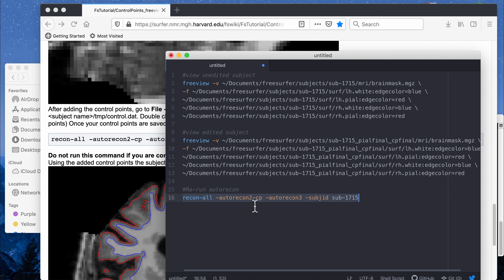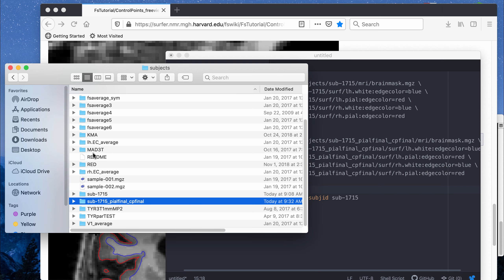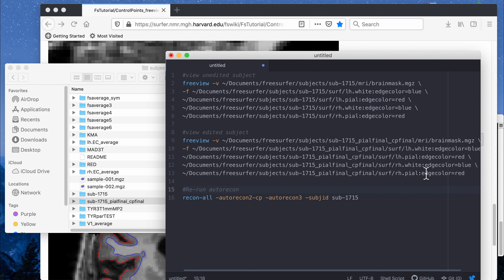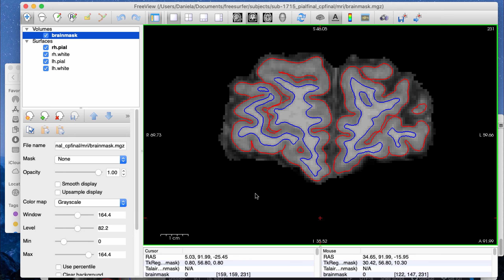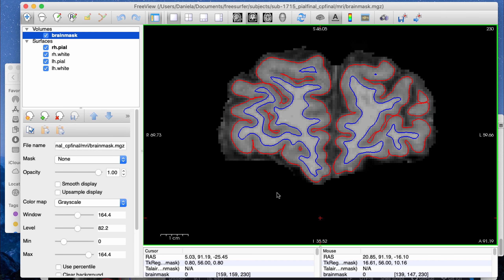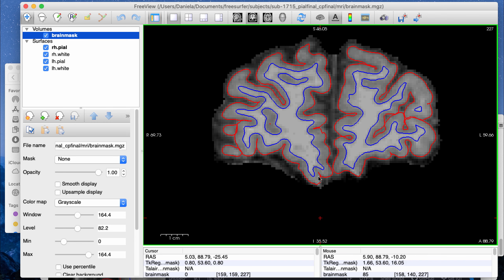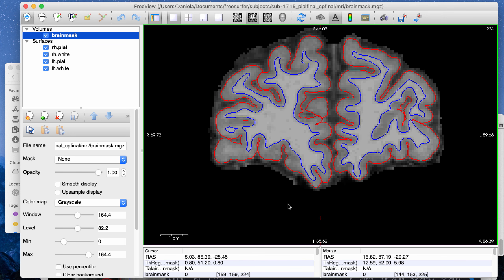I'm also going to load in the fully edited and manually corrected subject folder — I saved it as subject 1715 underscore pial final (with all pial edits) and cp final (with all control point editing done). After loading, this is the fully corrected brain. If you run the autorecon stage again after control point editing, you should see that the new blue white matter boundaries are extended beyond the control points you added, and the red pial boundary may also be extended depending on where you placed the control points.